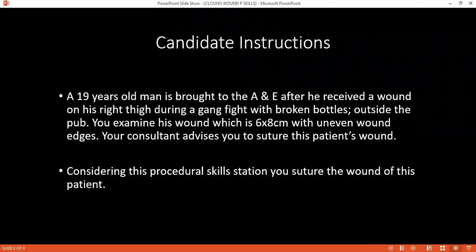I will ask the assistant for all the equipment. I need a suture which is non-absorbable and non-braided. Make sure who will be assisting you — most likely the examiner will volunteer to be your assistant.